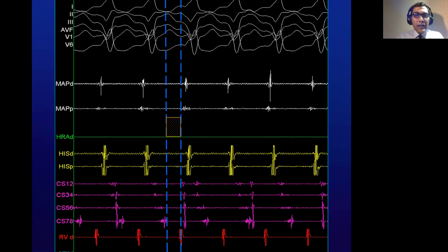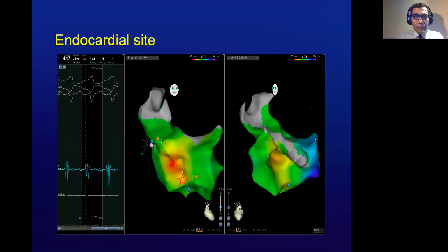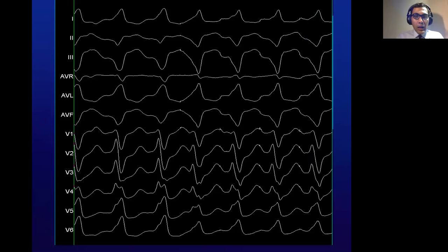The region in between these two remained to be mapped. The endocardial site where the previous signals were noted is as shown here. Entrainment was carried out at this location. Capture was confirmed. The entrainment visualization was suggestive of a manifest entrainment with signals with a 10/12 correlation.